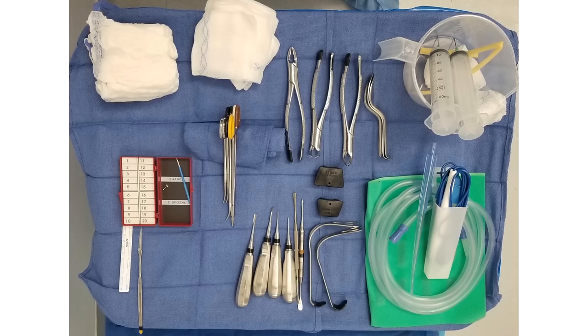This is our sharps box. And every time we use a suture, when we're done, we put the needle in a space right here. And this lets us keep track of how many needles we have. So when the nurse hands us a needle, she adds that to her list, or he adds that to his list, and they'll know that, hey, we gave you 5 needles during the surgery, and then at the end of the case, we want to see 5 needles here so that we know we didn't leave one behind in the patient. This box can be closed up at the end of the surgery so that no one pokes themselves, and we just throw it into a bigger sharps container.